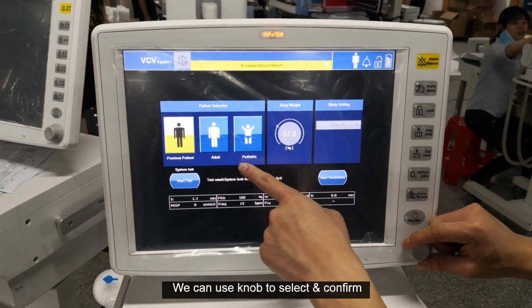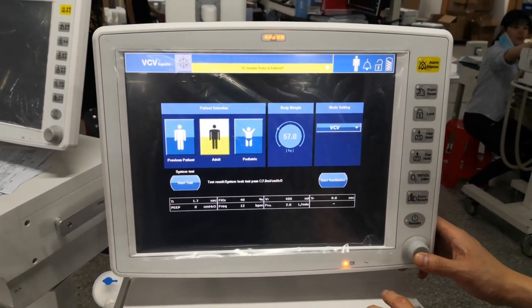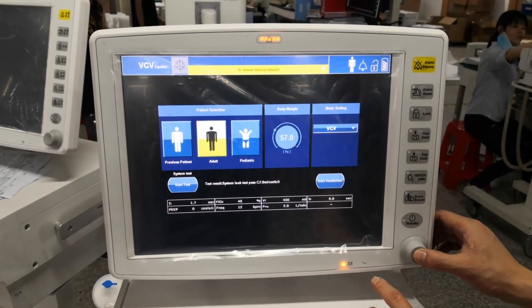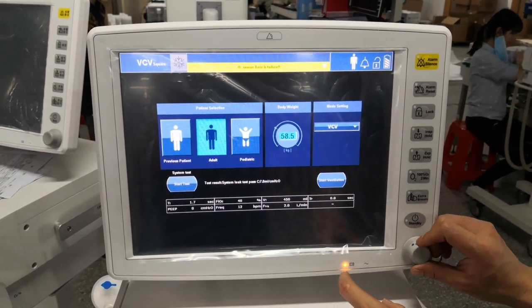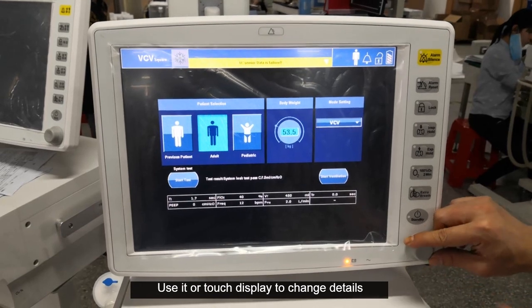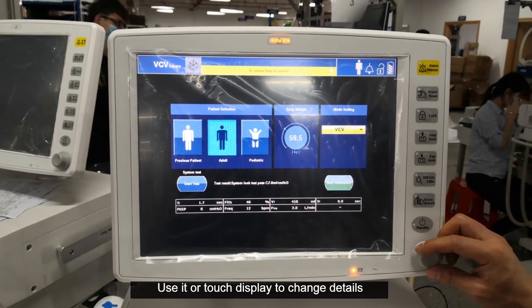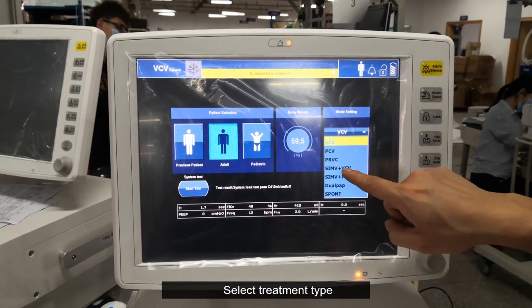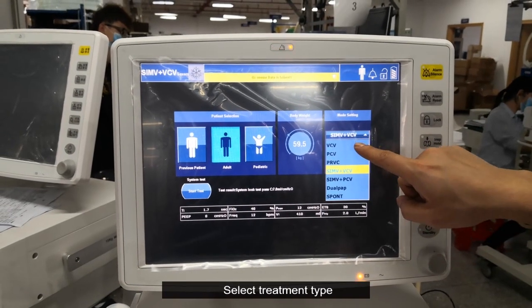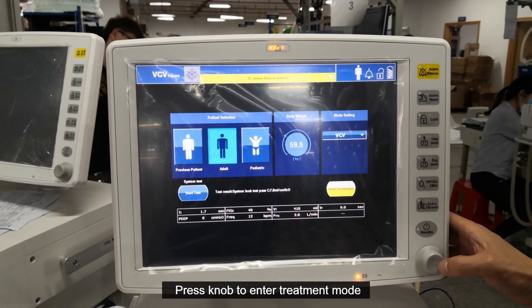We can use the knob to select and confirm. Use the knob or touch display to change details. Select the Treatment tab, then press the knob to enter treatment mode.